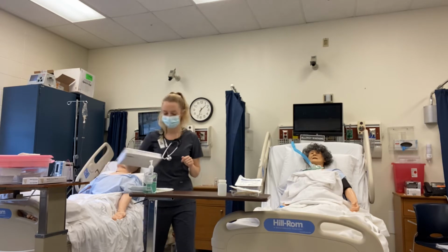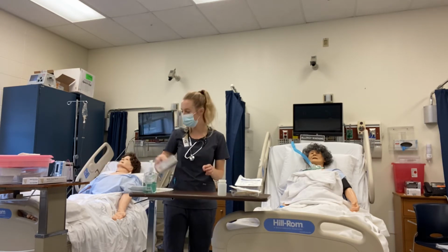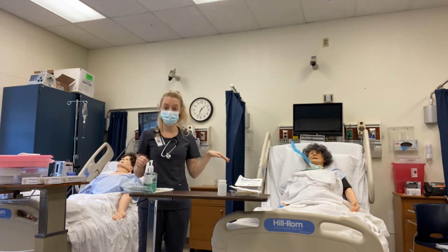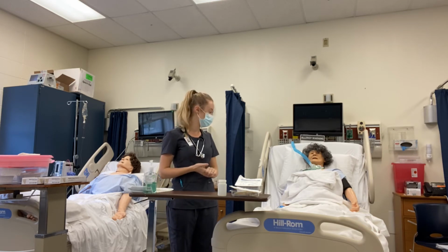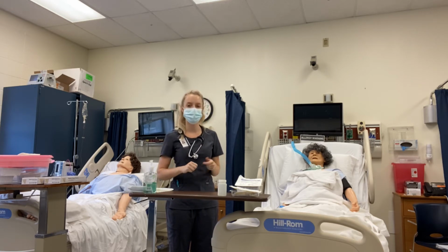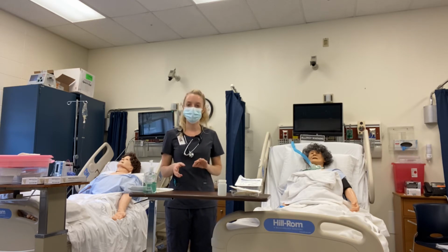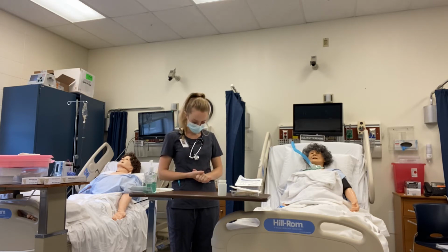Next, I'm going to turn on the suction equipment. I want it at about 80 to 120. I'm also not going to want to suction for more than a few seconds at a time, like about 10 seconds. Only apply suction on the way out and give Mrs. Jones a 30-second rest in between passes with that oxygen so that we don't desaturate her.